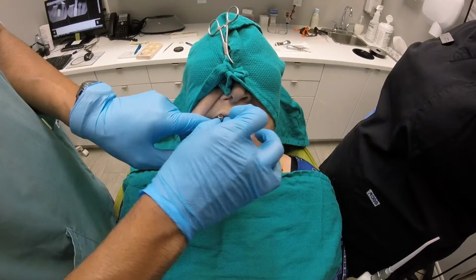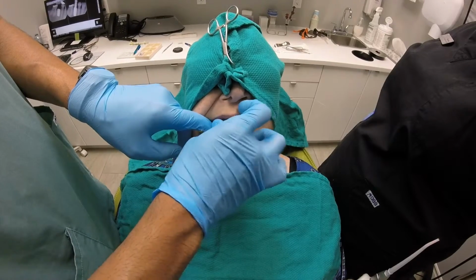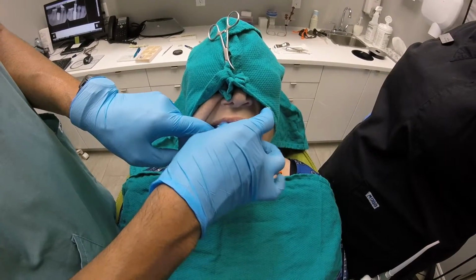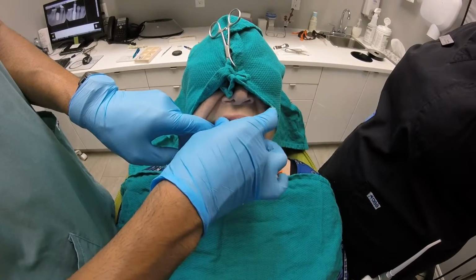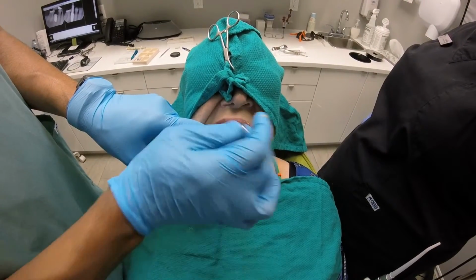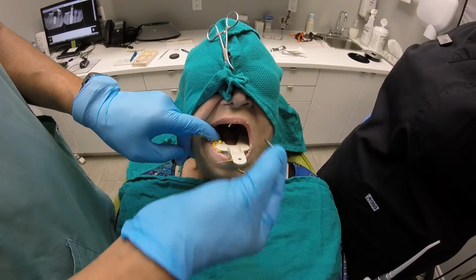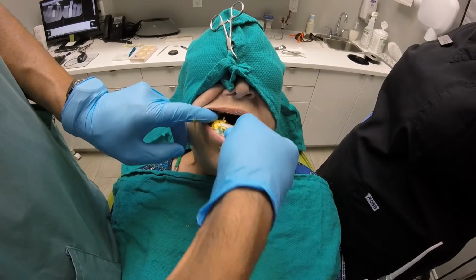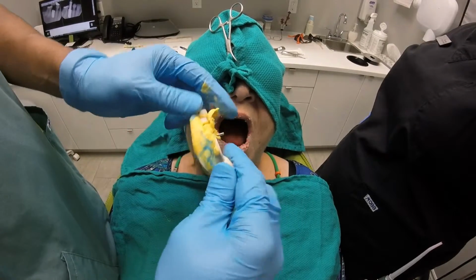So we're going to basically unscrew this impression coping, and the purpose of this technique is to basically pick up that impression coping, that transfer coping. Take the pin out, make sure the pin comes out. And more or less flip it upside down, make sure everything's been taken. As you can see, we've taken a beautiful fixture level impression using an open tray technique.